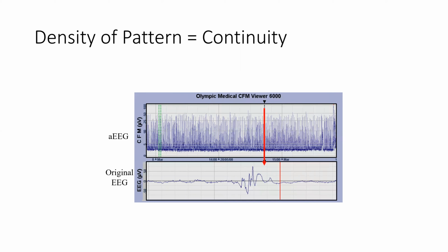Whether the activity is normal or whether the activity is bursting in an abnormal pattern, the density reflects continuity. And so I want you to say, or continuousness of activity, right? So depending on how you want to say that. So the density is really important.